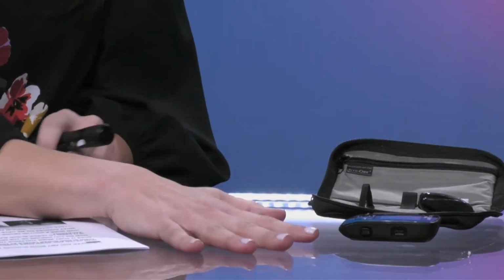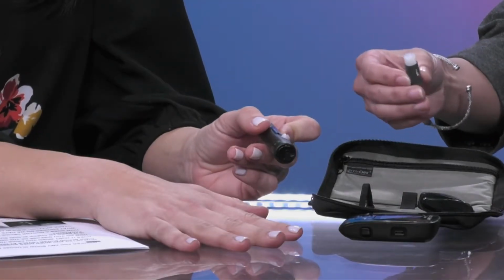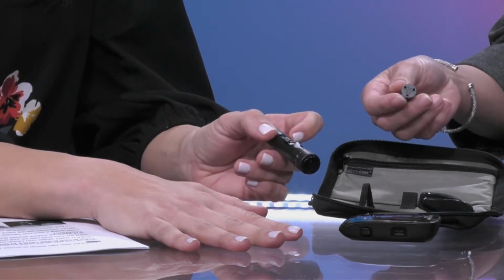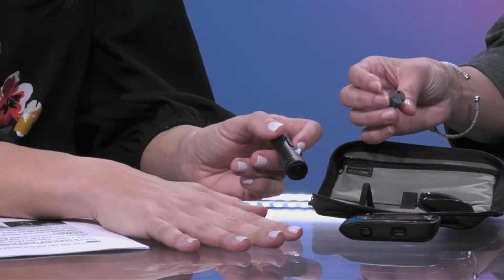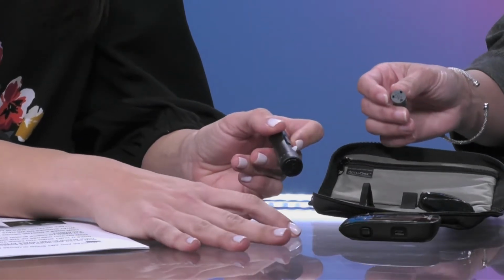Each of these lancet devices will be a little bit different. The one that Amy has, for example, uses a drum that's got multiple needles in it, and they're usually quite small. This one gives you the flexibility of up to 7-day checks. Each one of the companies, again, is going to be a little bit different. Sometimes it is just a prick. Exactly. So this is a needle system where, yes, you do have to draw blood.